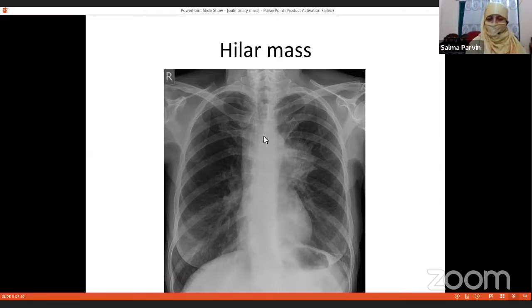This patient has rightward rotation when the exposure of the X-ray was taken. So the patient should have a rightward mediastinal deviation, because the mediastinum will not compromise anything whenever you take any sort of movement, any sort of pushing or any sort of cracking, it will follow the way. So whenever the patient is rotated to the right, you should get the mediastinum towards the right.